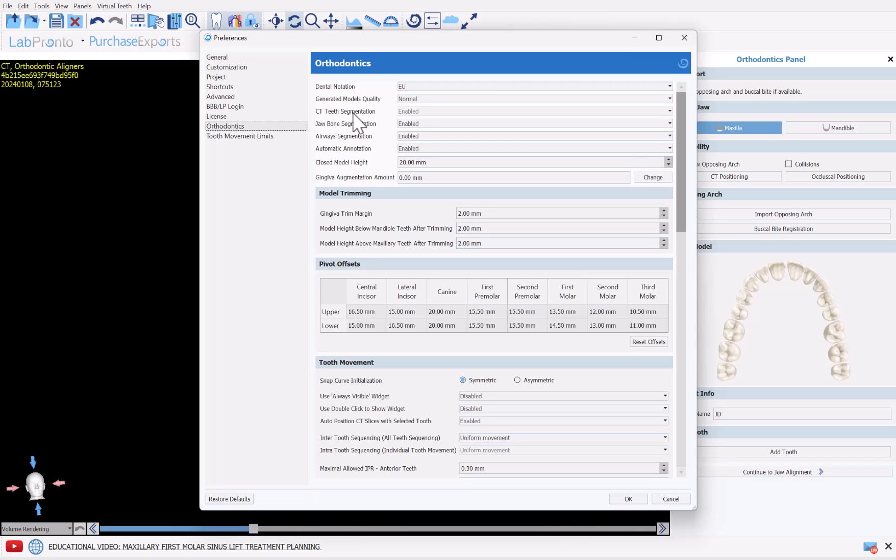And here we have the options of what should run automatically and what should not. So CT segmentation is always enabled. That's always enabled when you select the option of importing a patient CT scan, because that is exactly why you're importing the patient CT scan, at least to have the CT teeth segmented. That's enabled by default.